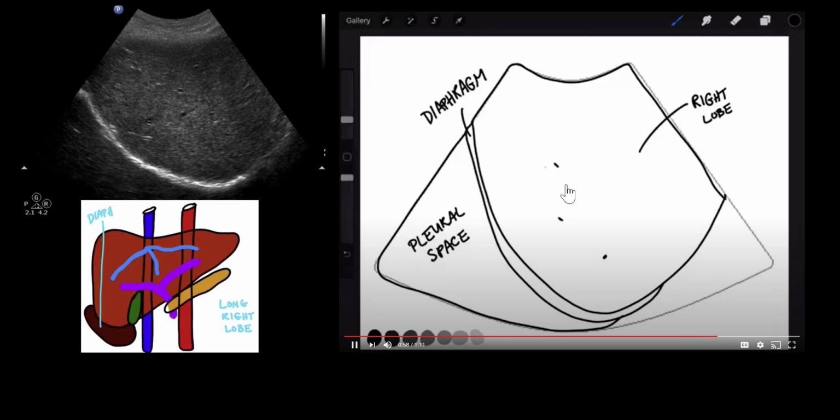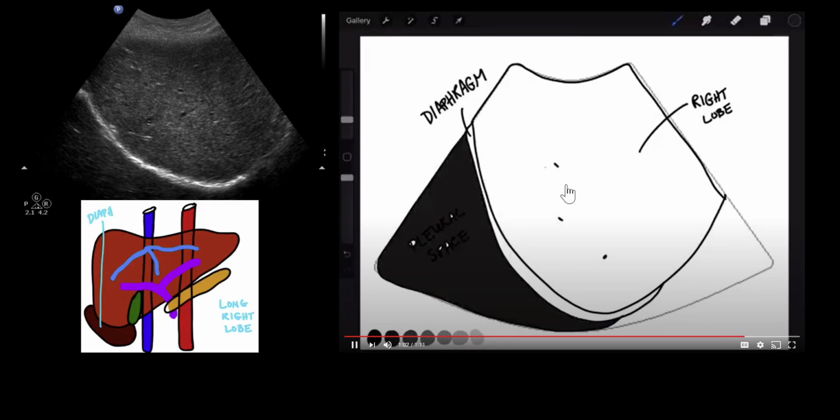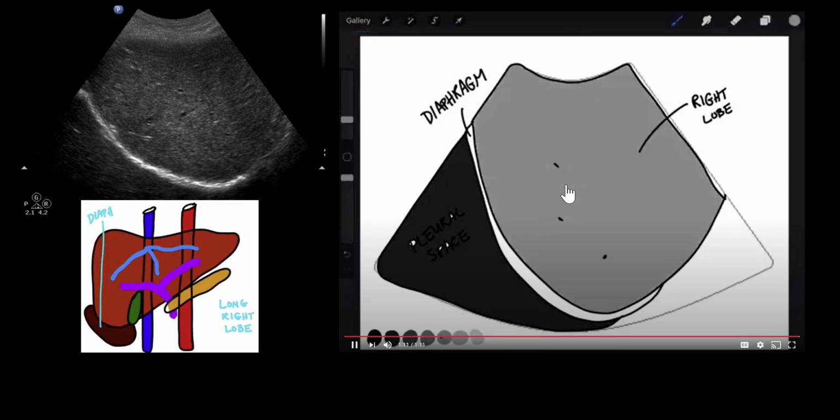This picture can be kind of tricky for new scanners. What I encourage you to do is look at your transducer when you go to get this picture. Make sure that you stay in a true longitudinal plane. A lot of people tend to want to start to oblique their transducer, and once they do, they kind of end up in between this image and the next image that we'll talk about. So again, make sure your transducer is truly up and down as you angle all the way to the patient's side. Our next image then is going to bring us into the transverse plane.